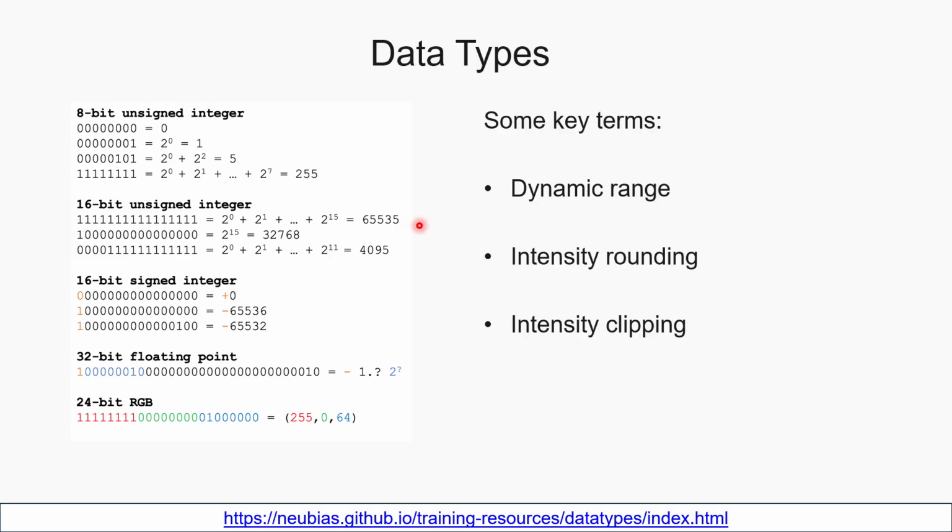The other situation that we need to consider is intensity clipping, or sometimes referred to as saturation. This occurs when values exceed the maximum representable limit and are therefore truncated. Therefore, data is lost because we don't truly know if the maximum value is the maximum value, or there were higher values that the fluorescent signal would have been. These concepts affect both image quality and quantitative analysis, and should always be considered during image processing.